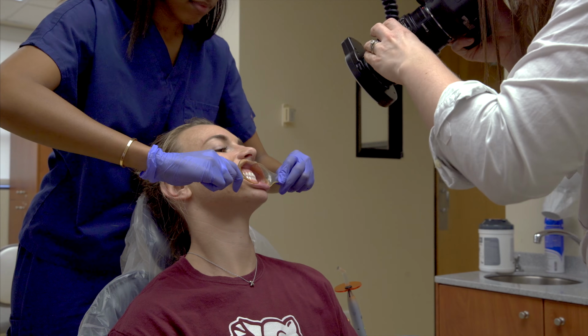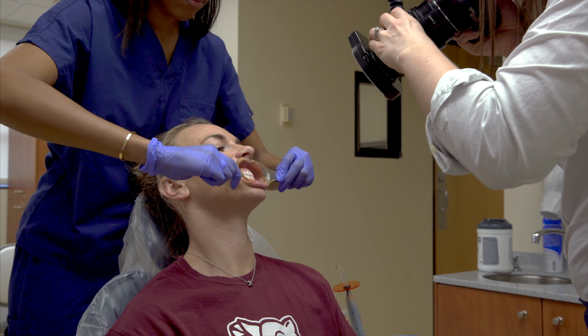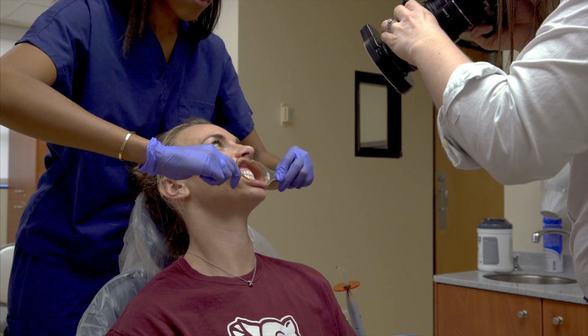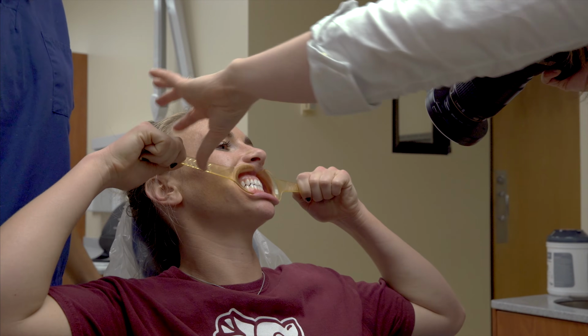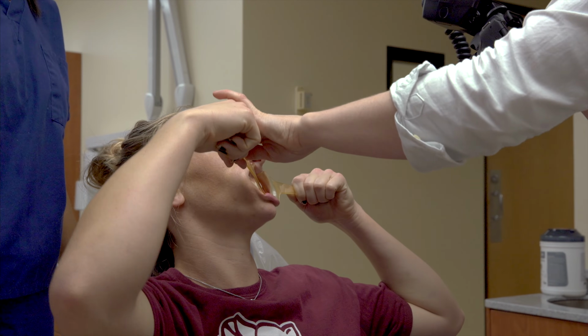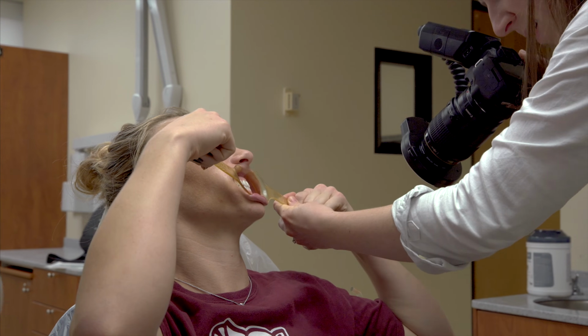The primary use for the plastic lip retractors is for the anterior facial shot. After that, we recommend using the metal retractors. Before starting any intraoral photography, have the patient lick her lips to prevent cracking. It may seem instinctual to apply chapstick or lip gloss. However, when the patient does that, it gets all over the mirrors, so I don't recommend that.